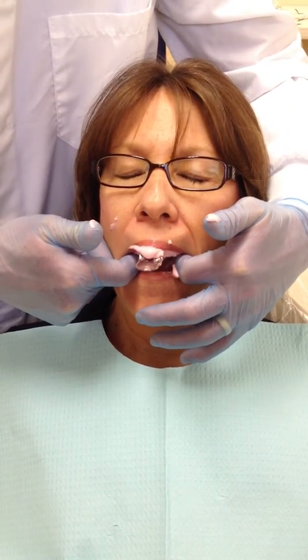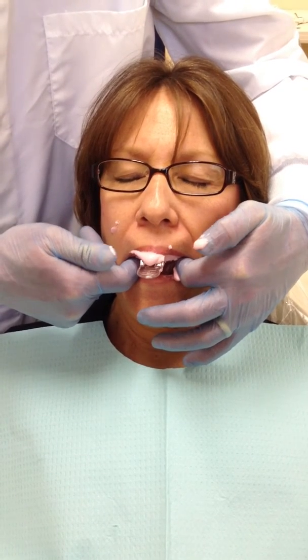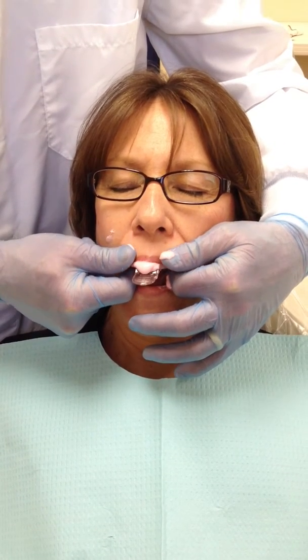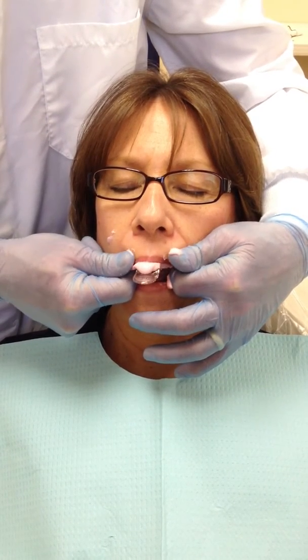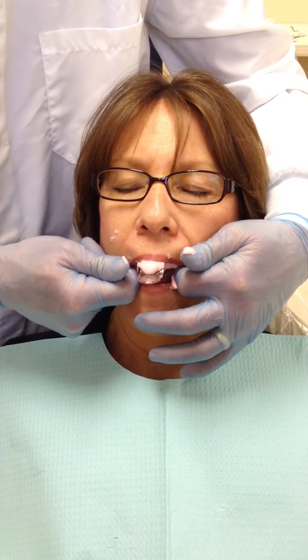Have them breathe through their nose, keep their chin down, and think happy thoughts. We mixed very fast, so this may take a little bit for this to set.